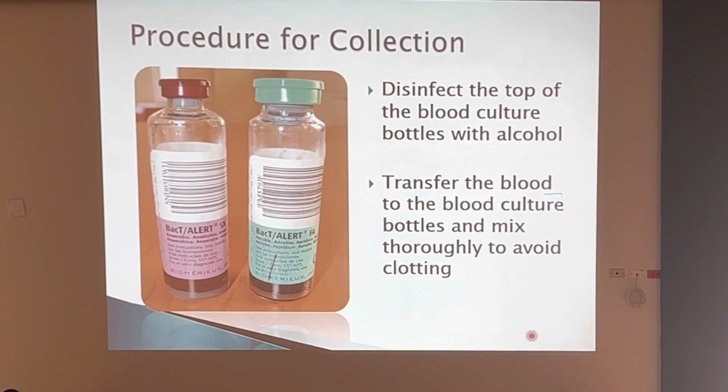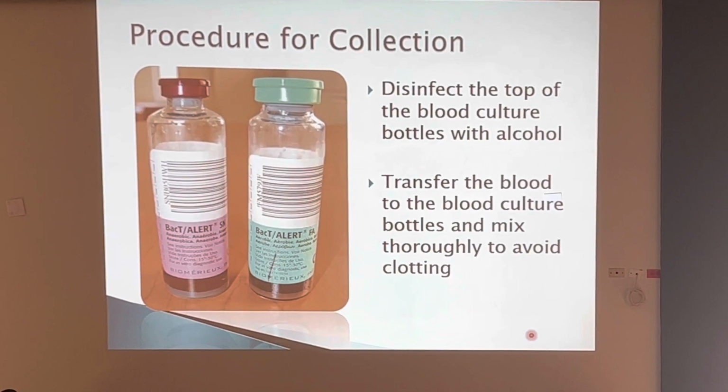You're just going to inject it into the septum there, and you're going to mix very carefully, not vigorously because you might hemolyze the blood, but mix very carefully, very thoroughly, so that the blood does not clot, right? Then you ensure that your samples are properly labeled.